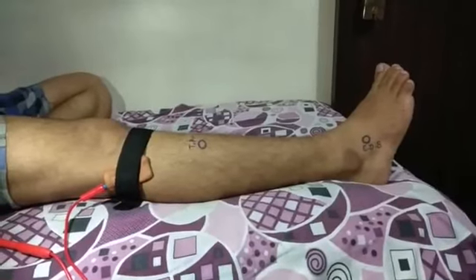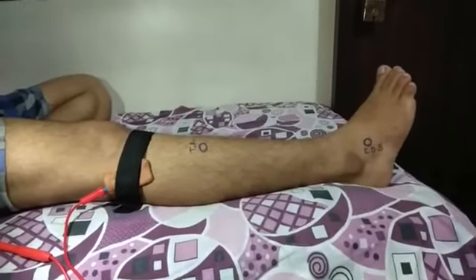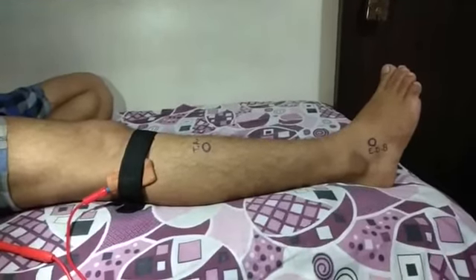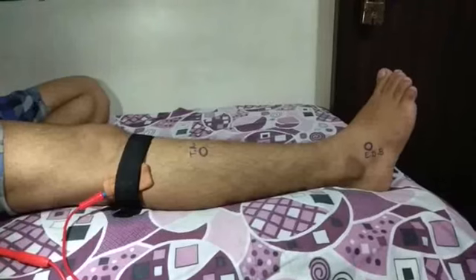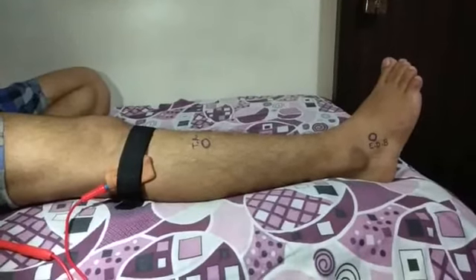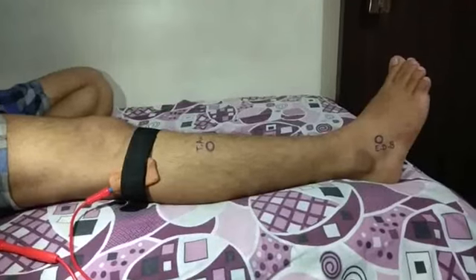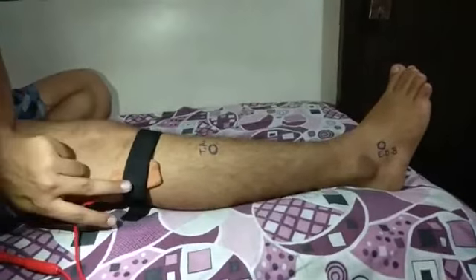Deep peroneal nerve, which supplies 5 muscles: tibialis anterior, extensor digitorum longus, extensor hallucis longus, extensor digitorum brevis and peroneus tertius. Reference electrode for the common peroneal nerve we can place at the lateral side of the head of the fibula.